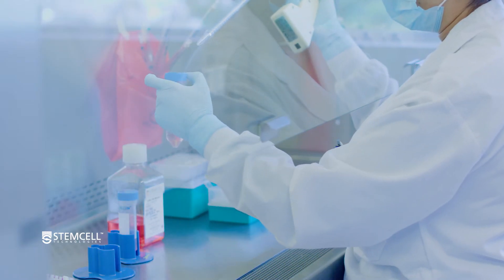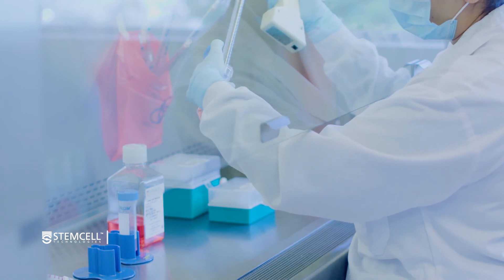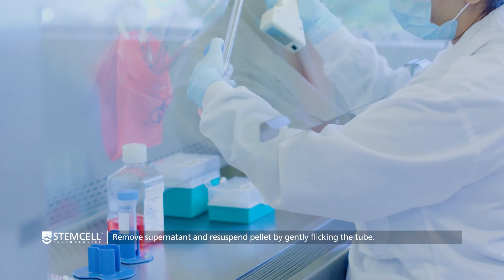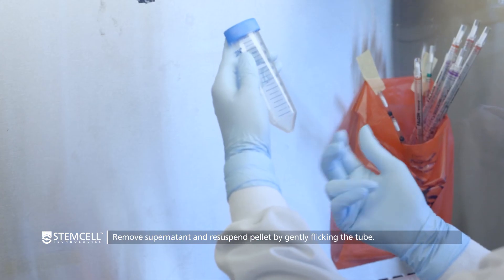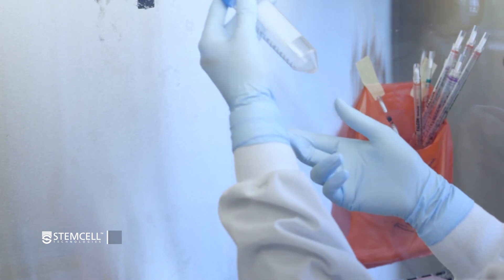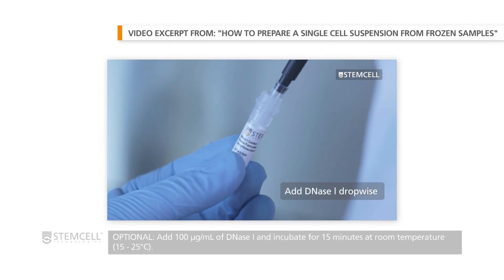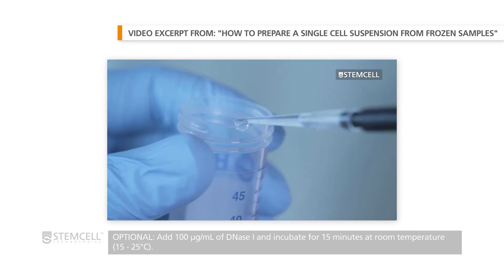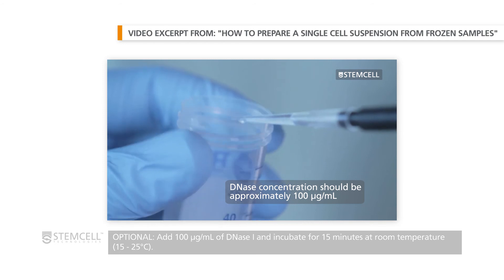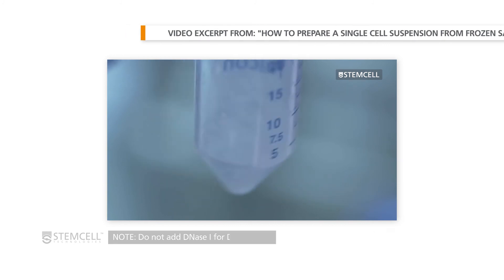After centrifugation, carefully remove the supernatant with a pipette, leaving a small amount of medium to ensure the cell pellet is not disturbed. Resuspend the cell pellet by gently flicking the tube. If cells are starting to clump, add DNase-1 solution to a final concentration of 100 micrograms per milliliter of cell suspension and incubate for 15 minutes at room temperature. Do not add DNase-1 solution if the cells will be used for DNA or RNA extraction.